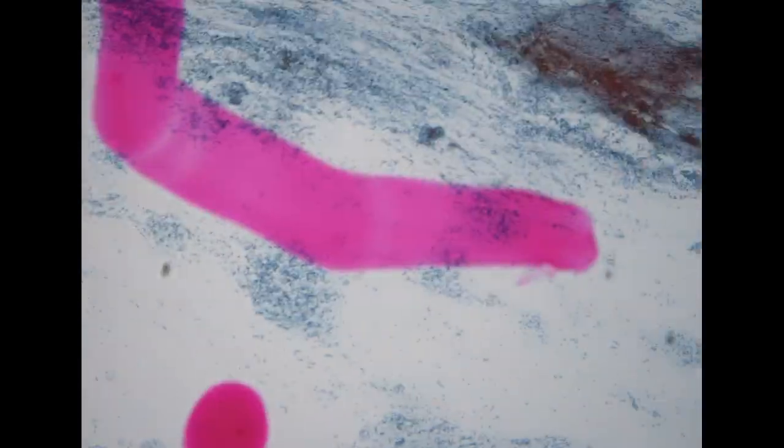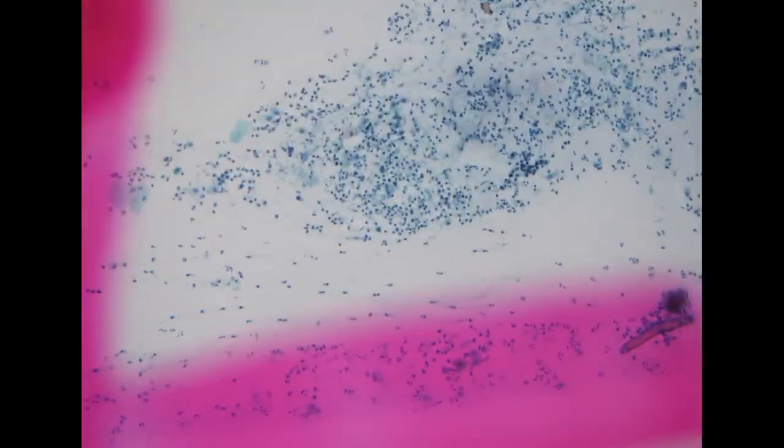So in such a specimen, usually we will go through the debris area to see if there are any atypical glandular cells. For this specimen, I didn't see any atypical glandular cell, but only the endometrial debris.